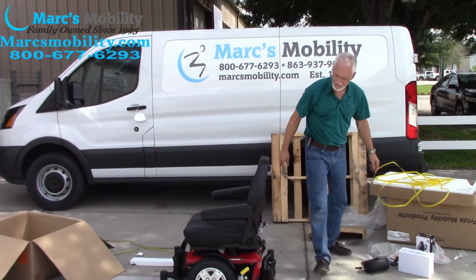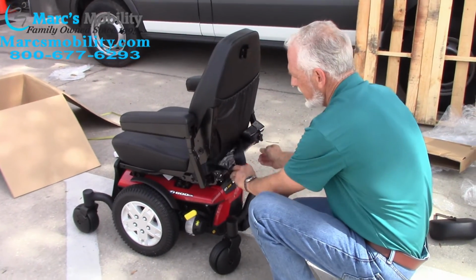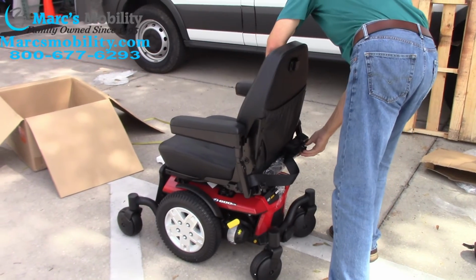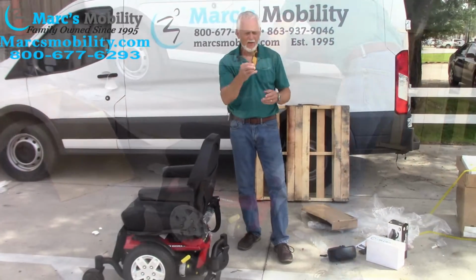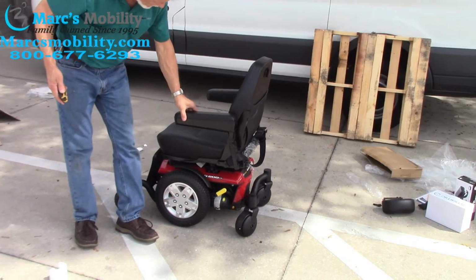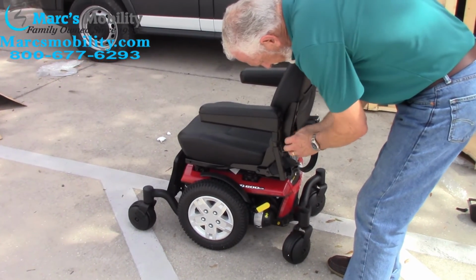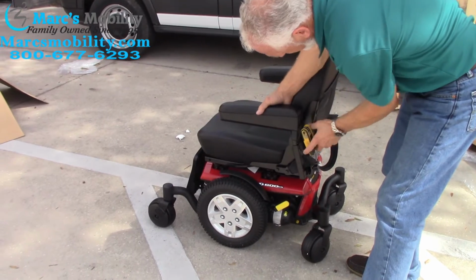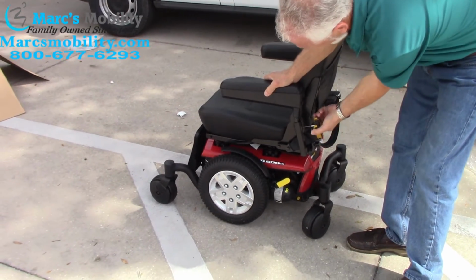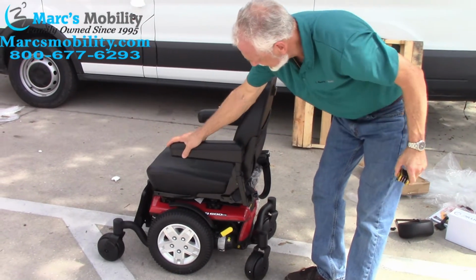Now, 2 things. When you have the arms on, if you tighten up this bolt, this is your safety belt over here. We're going to get it out of the way here for a minute. Tighten up this little knob right here. Tighten it up. It takes away all that play. Do both sides. The next thing you'll do, you'll take your Allen wrench and you'll adjust the height of the arm. You still got a little bit of play here. On each side, right here and right here, you can put your Allen wrench in here and tighten up these screws, and you can adjust the height. Let me go back a little bit. You can adjust the height as high as here, which will be way too high. I'm just going to put it all the way down. Turn the Allen screw with your Allen wrench. You have one on both sides, okay? You see how the arm is solid now.